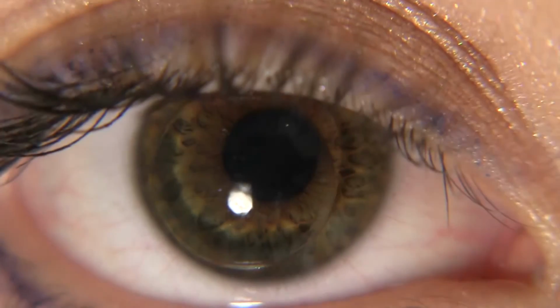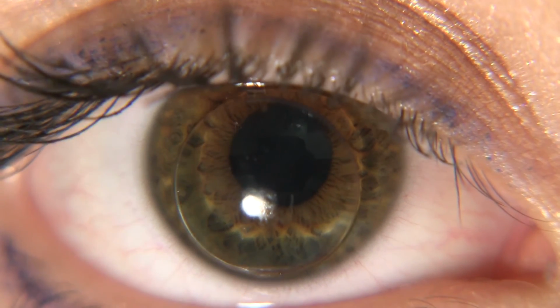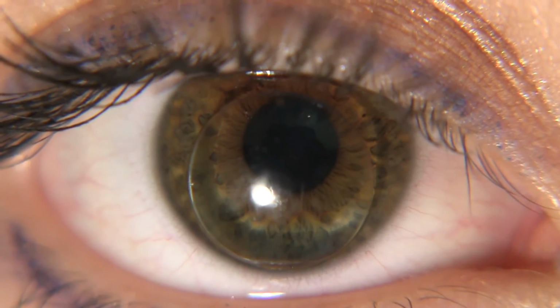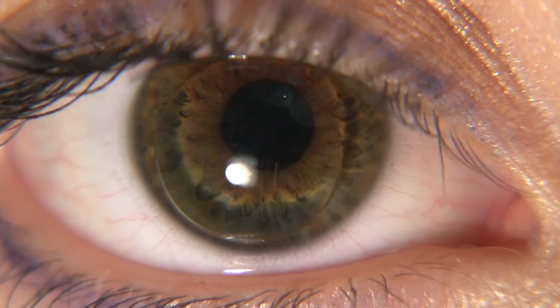If the lens is not resting on the lower eyelid, if it is lid attached or moving too much with blink, we can adjust the lens base curve so that it fits a little tighter to the eye, or we can decrease the lens overall diameter so that it interacts with the upper lid less, which makes it more apt to rest on the lower eyelid to improve distance vision quality.